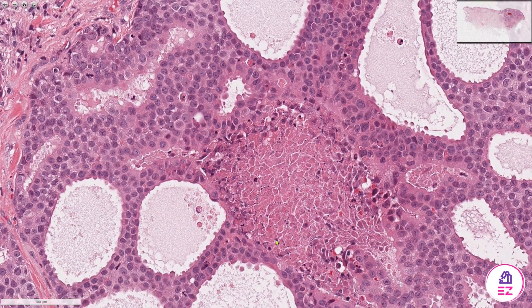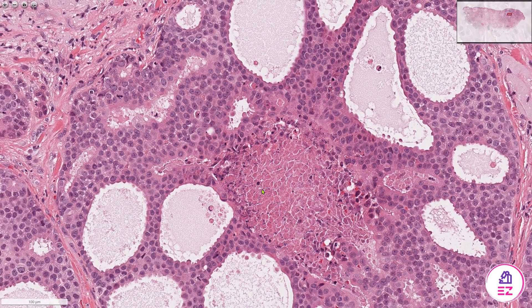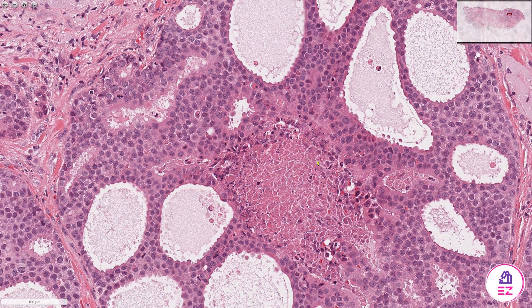If we look more closely, we can see that some of these cyst-like spaces contain comedotype necrosis. Whenever I see necrosis in salivary gland tumors, I tend to associate it with high-grade tumors, and a salivary duct carcinoma is considered a high-grade salivary neoplasm.